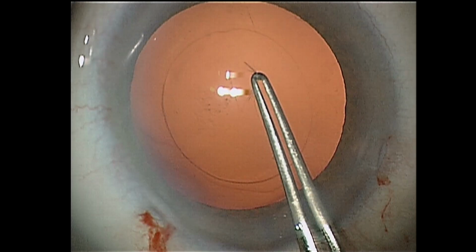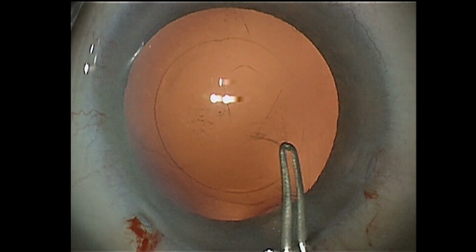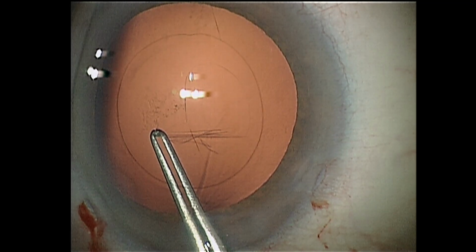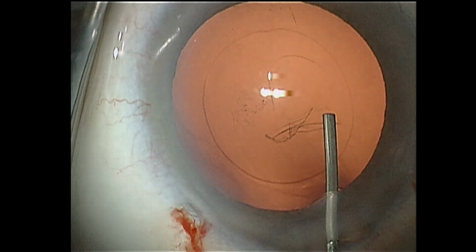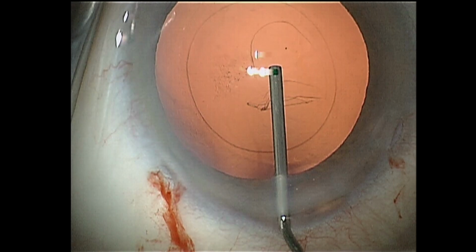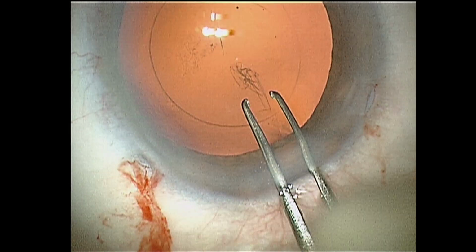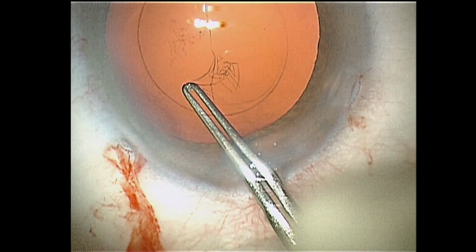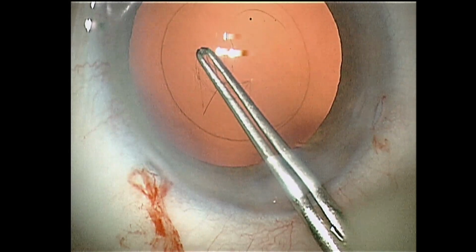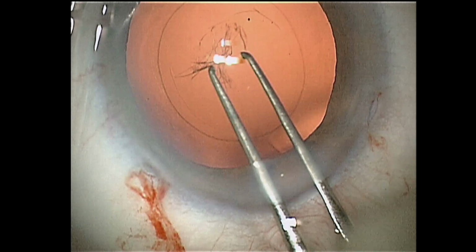Instead, the edge of the capsule slit is grasped with blunt capsule forceps, and the capsulorhexis is initiated. Only now is OVD injected in order to separate the anterior hyaloid from the posterior capsule. This avoids injection of OVD into the vitreous body should a firmly attached hyaloid have been inadvertently punctured together with the posterior capsule. The posterior capsule edge is then regrasped by forceps, and the capsulorhexis is completed with 2 or 3 additional passes.